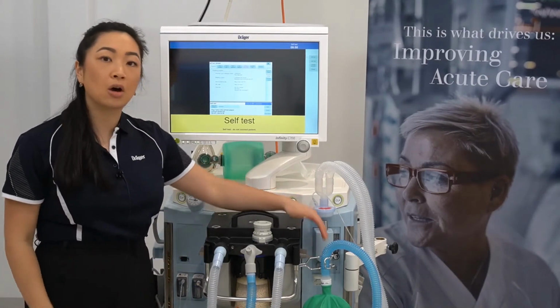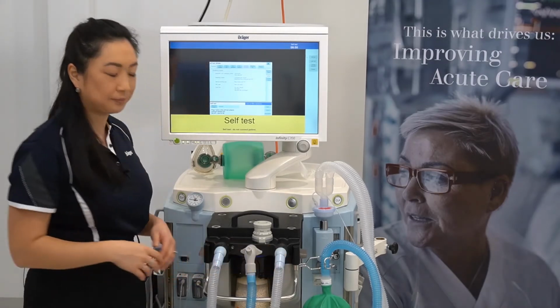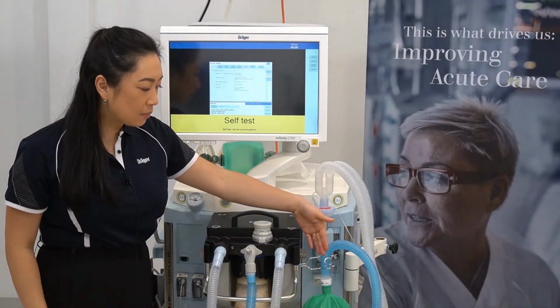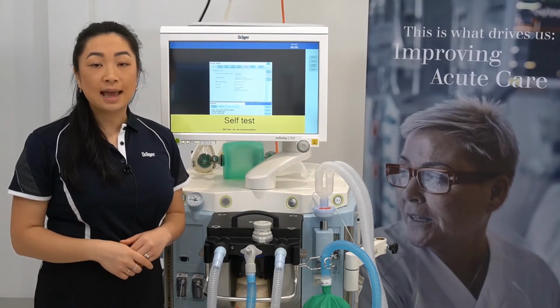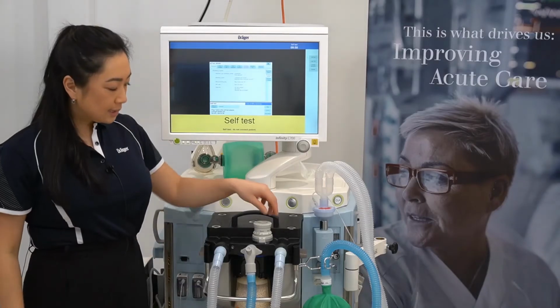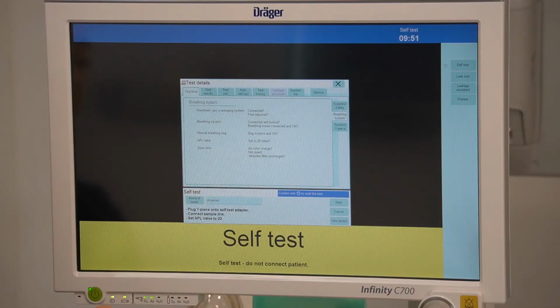To verify your gas cylinder pressures, open the valves to check the indicators are on, remembering to close them. When you open up the valves on your reserve gas cylinders, an LED light will represent adequate reserve cylinder pressures. If the LED light is flashing, there is inadequate pressure in your reserve cylinders. And in this instance, there are no LED lights, which means that there are no reserve gas cylinders on the back of the device. Just ensure to close the valves on your reserve cylinders to prevent inadvertent depletion during operation.